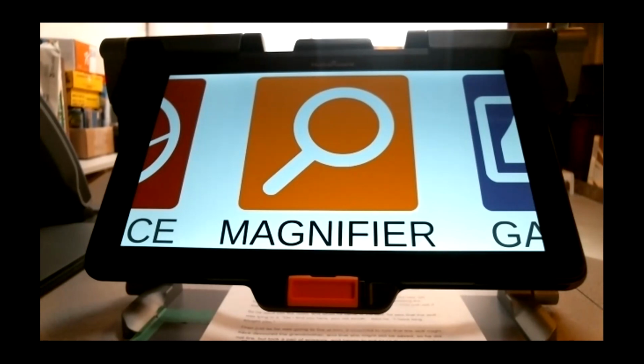Less than 6 months. Now, I don't know if you are new users or you had the Connect 12 and were scared of using it. But I hope that after this webinar, it's going to be a bit less daunting, the task of teaching or using the Connect 12. So I'm going to end the poll here. That's great. 42% of you have been using the Connect 12 for less than 6 months. That's awesome. The Connect 12 has been on the market for almost 4 years now, so it's awesome to see that new people are starting to learn about it and use it.